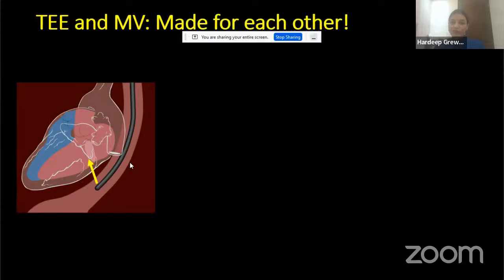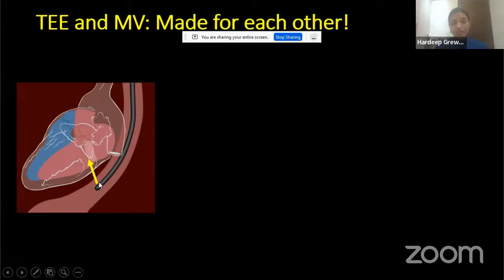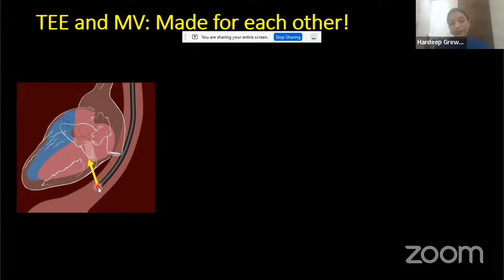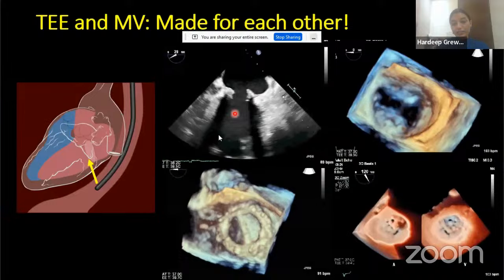Mitral valve assessment using 3D has become increasingly frequent. The reason we get good quality mitral valve images with TEE is that the transducer is in the esophagus, and the ultrasound beam first scans the posterior cardiac structures — which are in the near field. Structures like the mitral valve, left atrium, and left atrial appendage are in that near field, which is why TEE gives very good quality images for mitral valve imaging.